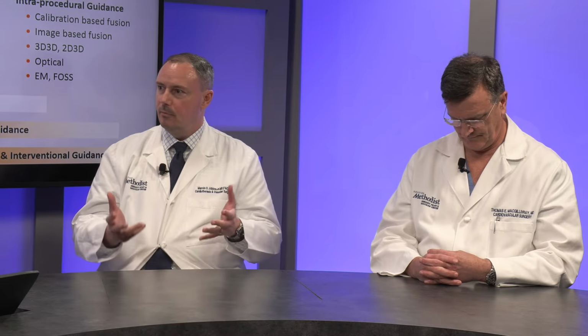Think about intravascular ultrasound, especially in the setting of aortic dissection, just how dynamic that flap is and how often that can change your plans when you're looking at patients that have mechanisms of malperfusion and trying to sort those things out intraoperatively. It would be great to use imaging beforehand, before you even got to the operating room, to figure out some of those things on a dynamic level as well.